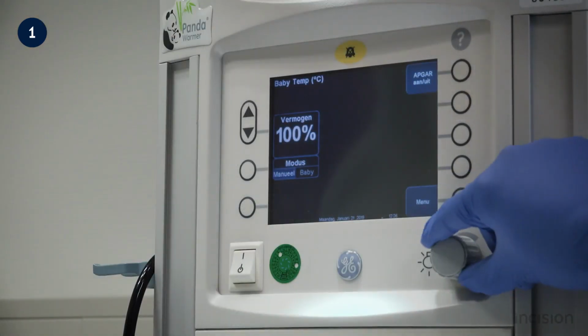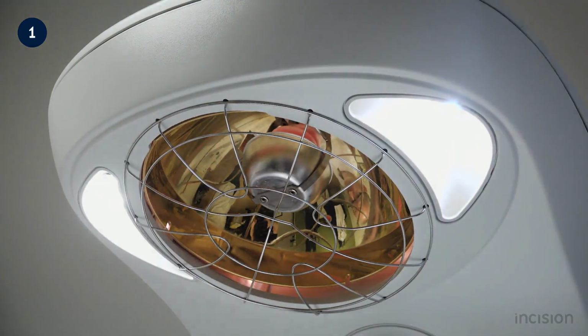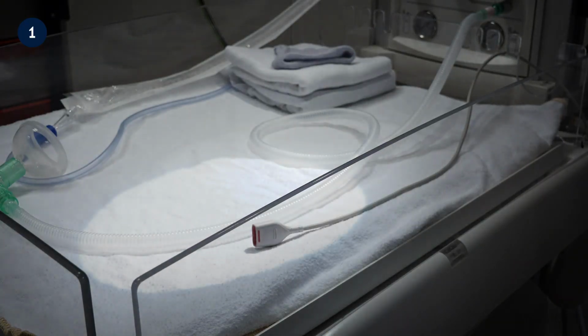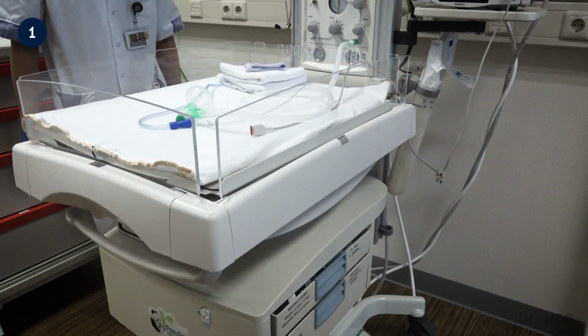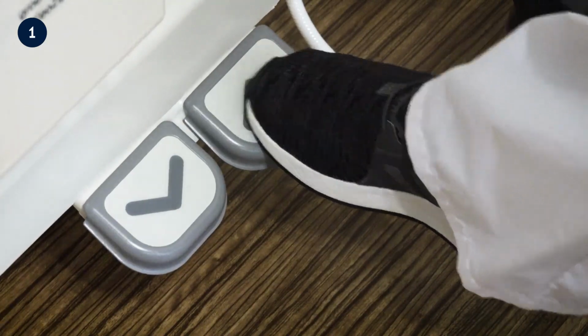The light can be controlled by either using this button or the smaller light at the top of the table. Note that the resuscitation table can be adjusted in height using the panels at the bottom of the table.